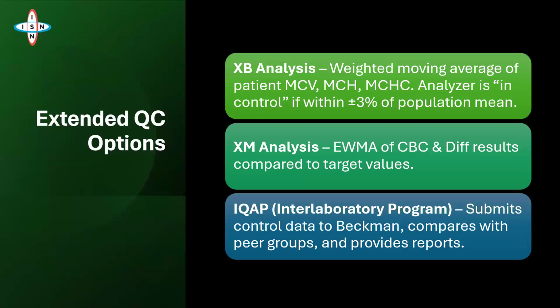Results compared to target values. Then we have the IQAP, which is an inter-laboratory program. So for this IQAP, if you want to set up this IQAP, you have to procure your commercial controls, and you submit your control data to Beckman.